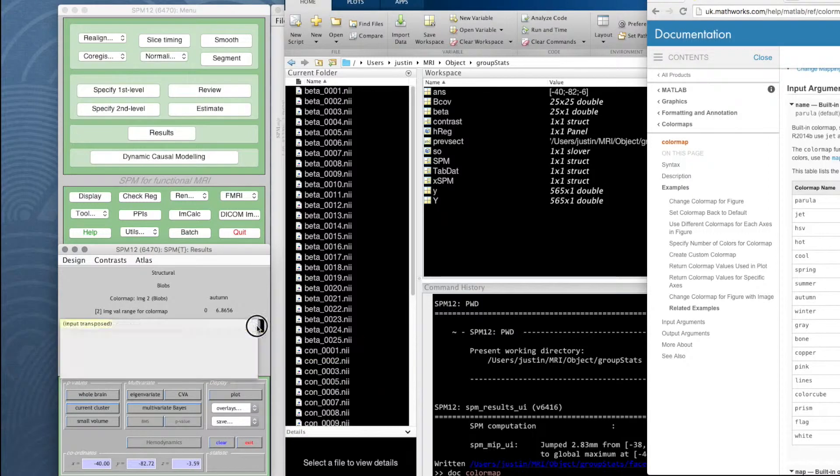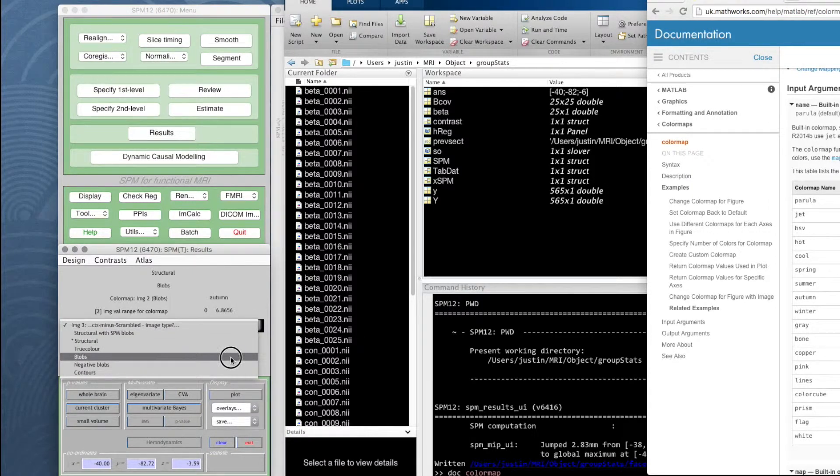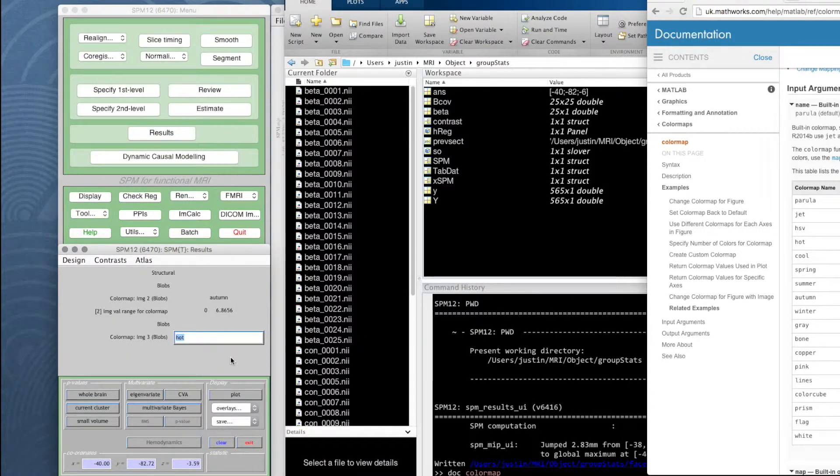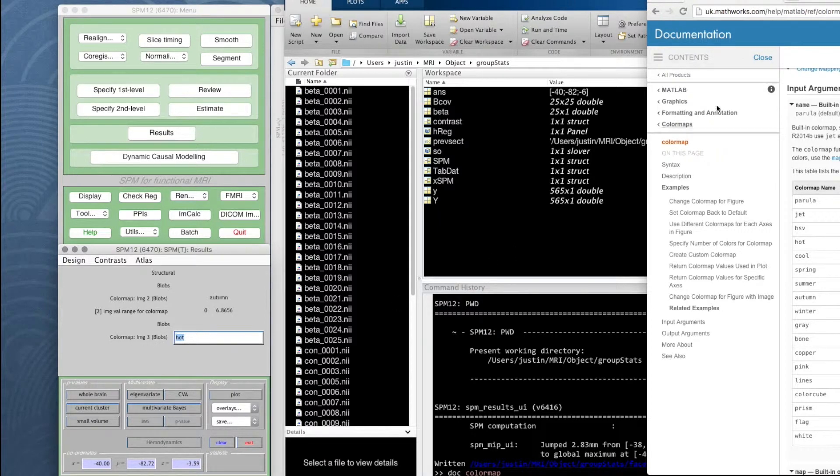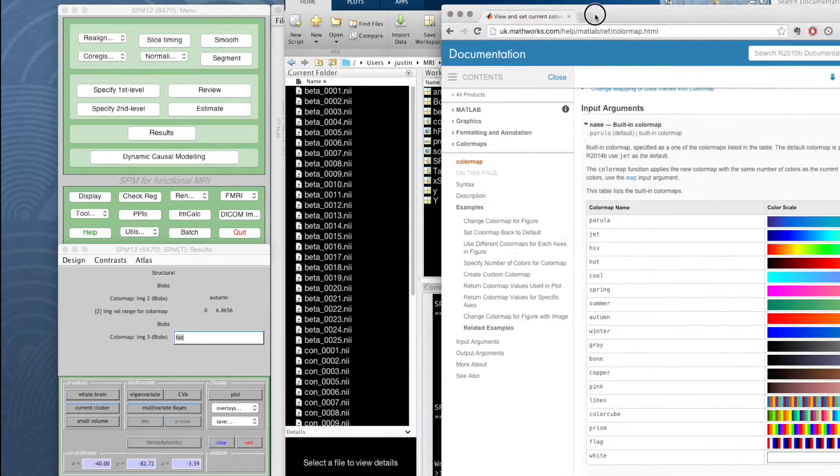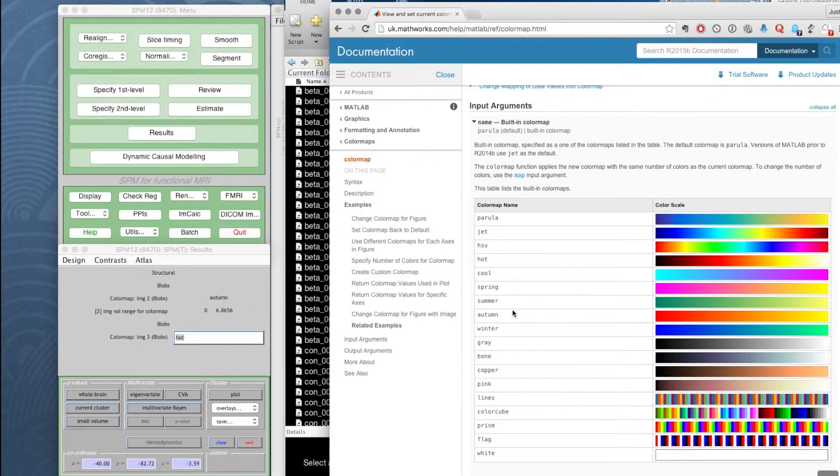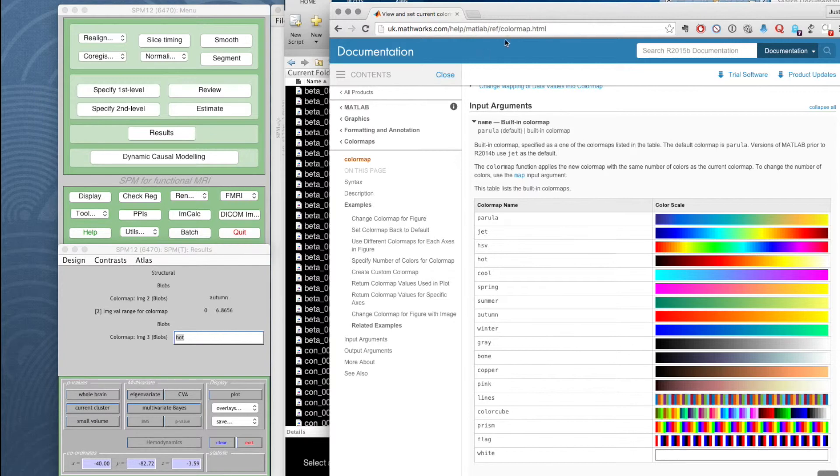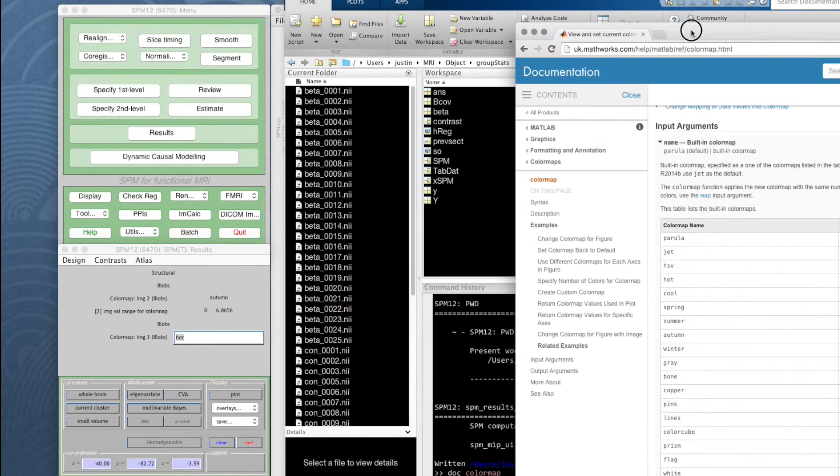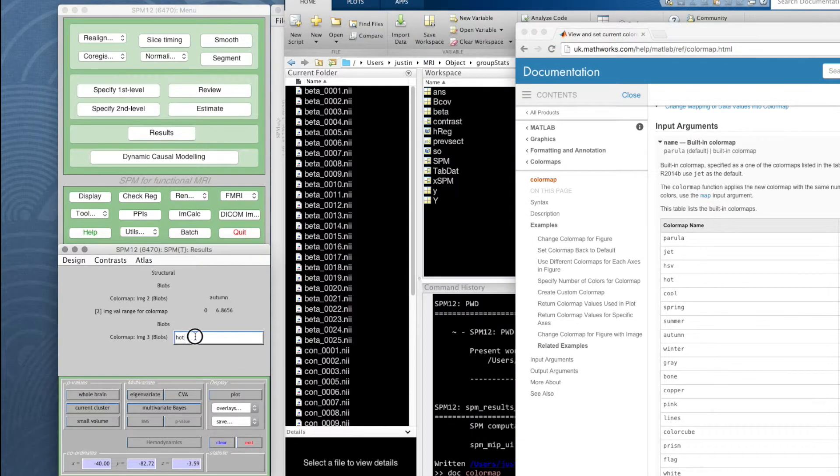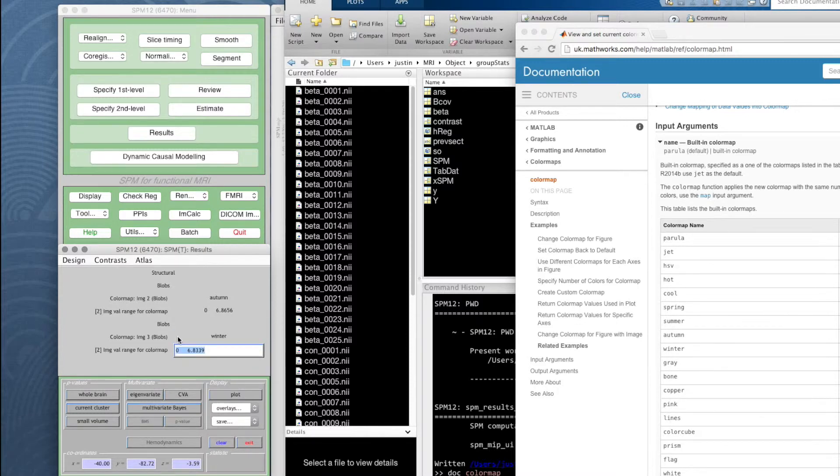The third image, also blobs, is the objects minus scrambled. And I think for this we'll use winter colors. So we'll use winter and it's just giving us the range of the t values that are in the image. We'll just use all of those.